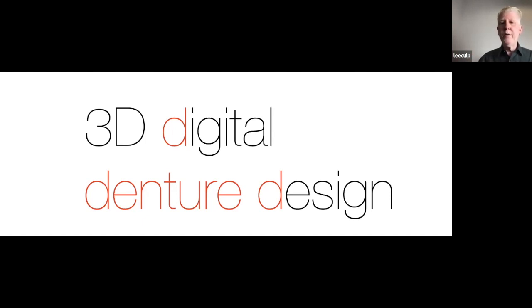So what we do is we take some red resin stain and we mix it with the white and then apply it to the inside and basically press it down onto the bar. And then we've got a pink opaque bonding agent to bond the bar to the PMMA so the metal doesn't show through. Okay, cool.